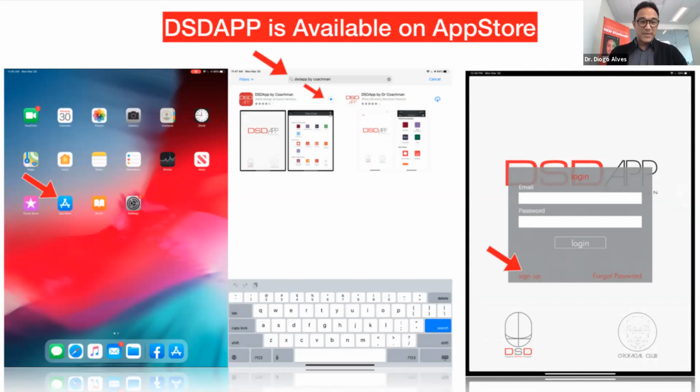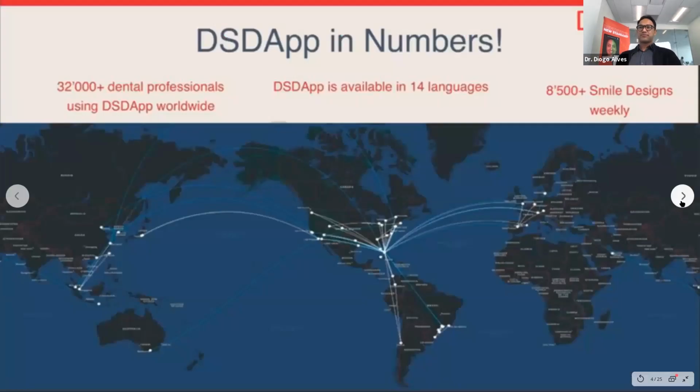Awesome. So we have here a doctor from Bulgaria, a doctor from Baghdad. We have Dr. Ala, who is asking if we have an online course. Yes, we do. So stay with us. You will get an overview of what you're going to get. It's a lot of content, but a lot of exciting content. And I'm very proud to be part of this webinar today. Absolutely. Just so you know, we at DSDAPP have over 32,000 doctors from all over the world.